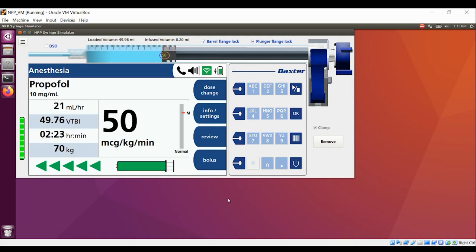Okay. Bolus would be programmed and delivered exactly the same way as on the LVP. So I'm not going to go over that. You can refer to your LVP for bolus examples and playing with it. So that's pretty much the anesthesia care area.